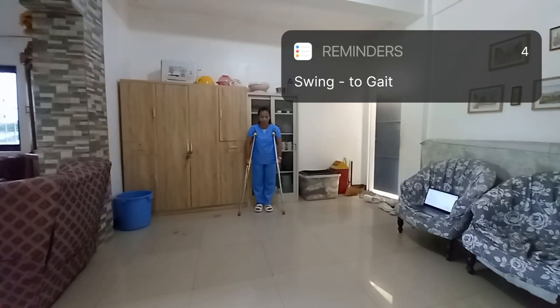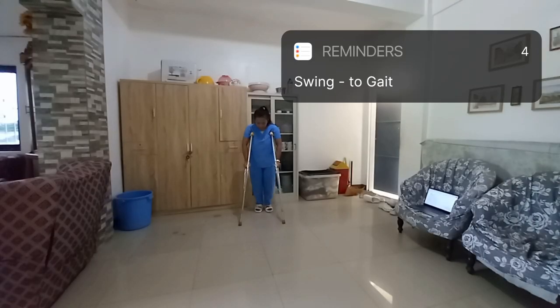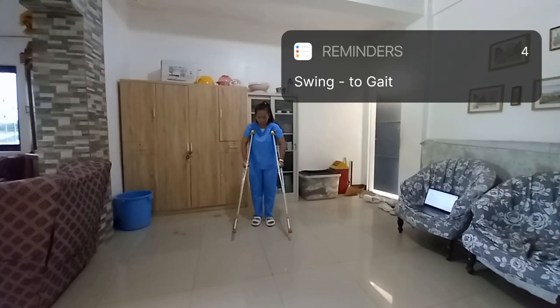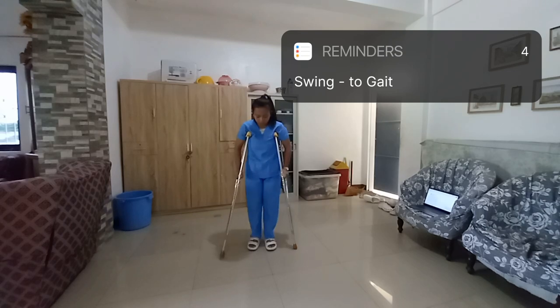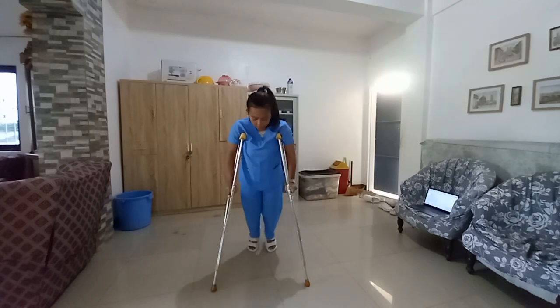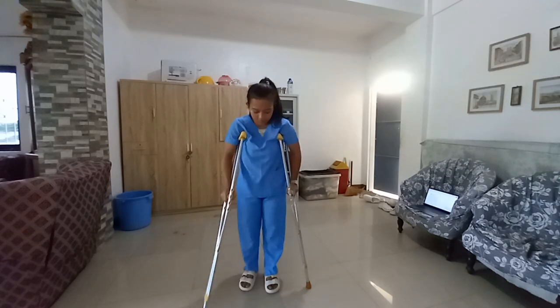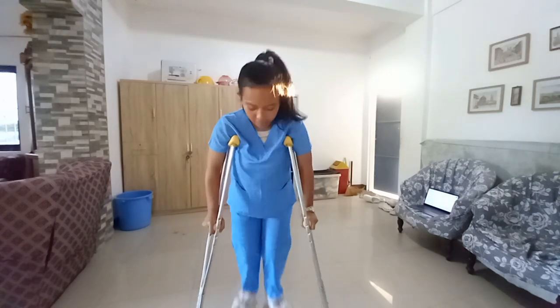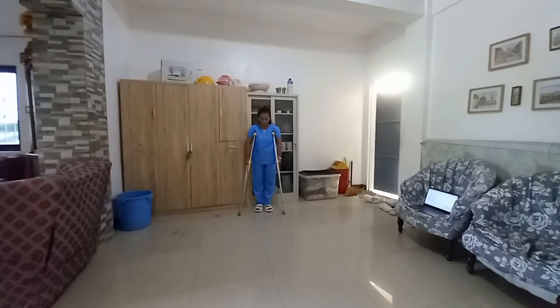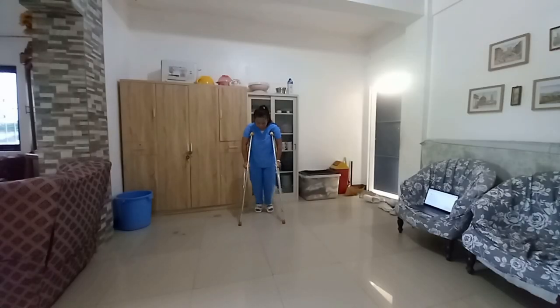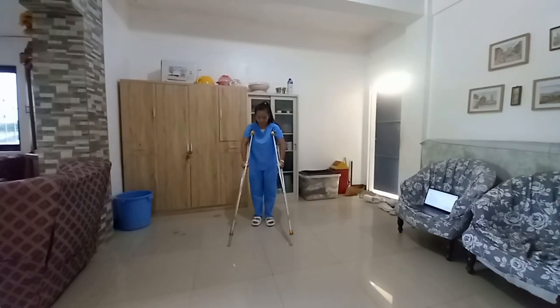For the swing-to gait, have the patient move both crutches forward about 12 inches. Then have the patient lift the legs and swing them to the crutches, supporting his or her body weight on the crutches.